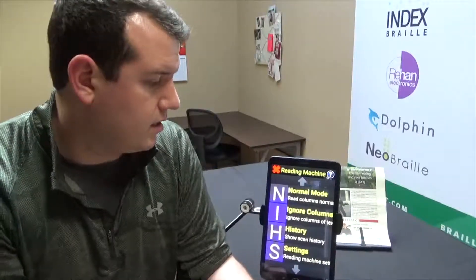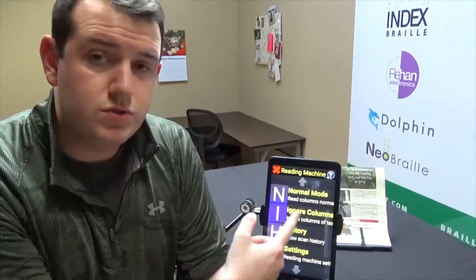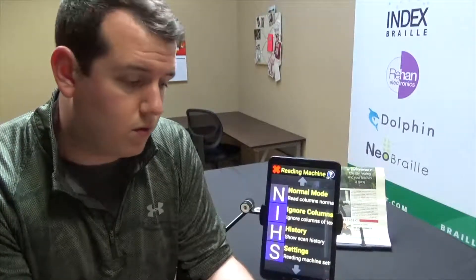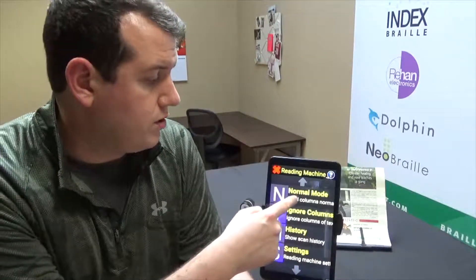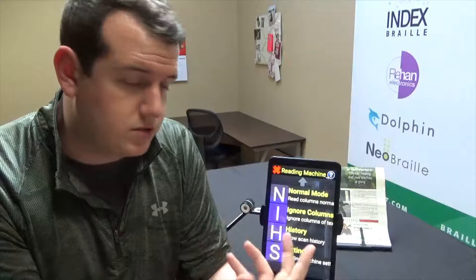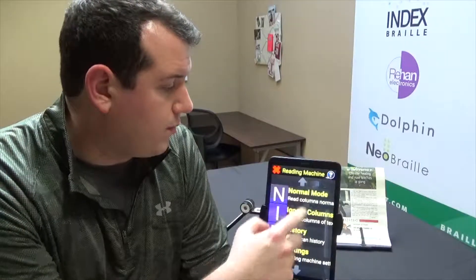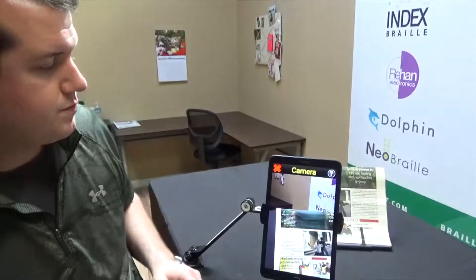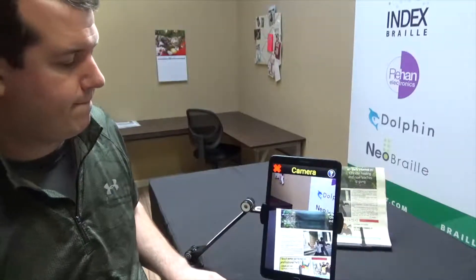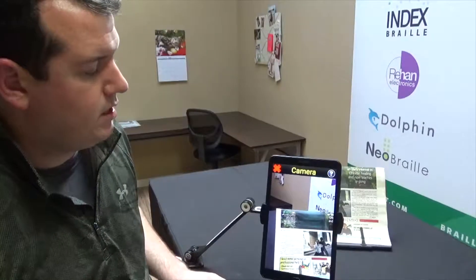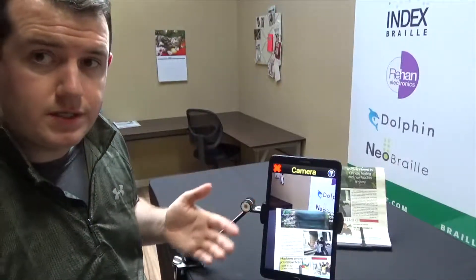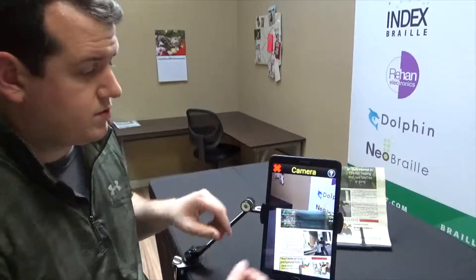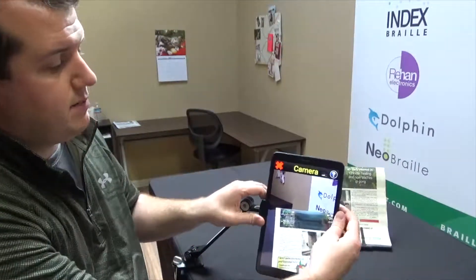You can also choose to ignore columns if there are columns on a page that you want to ignore, or you can just do Normal mode, which will scan and read as usual. Press Normal, and it says 'touch the screen to take the photo of the text.'